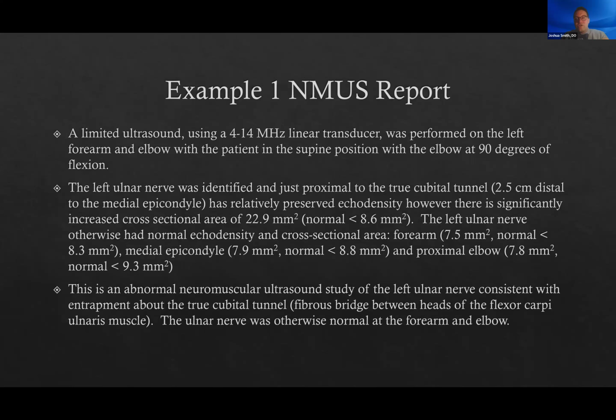And if you really like to do inching, you could do that. I think it's a lot easier to just do an ultrasound, put the gel on, and get the pictures. Also, I don't know about you, but when you do inching, you're doing your delta changes and you're wondering, was I really on the nerve there? Is that really the best spot where it's dropping? You're thinking about where you're stimulating and where the nerve is below. You can surmise ways in which things can be a little more off, versus ultrasound, which shows the anatomy of what is there and what is going on.